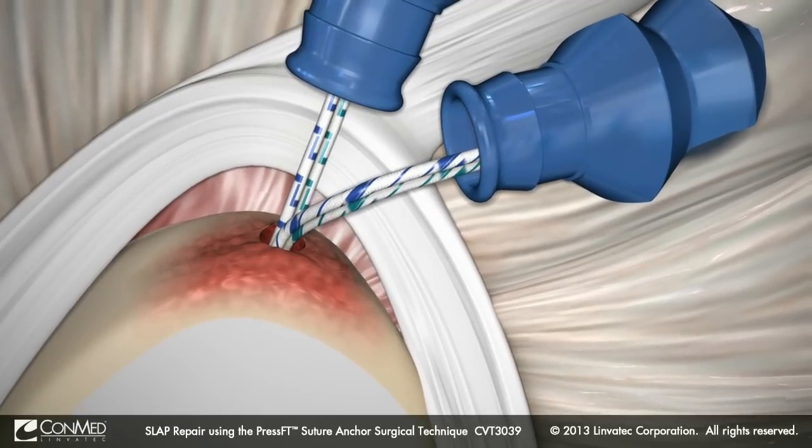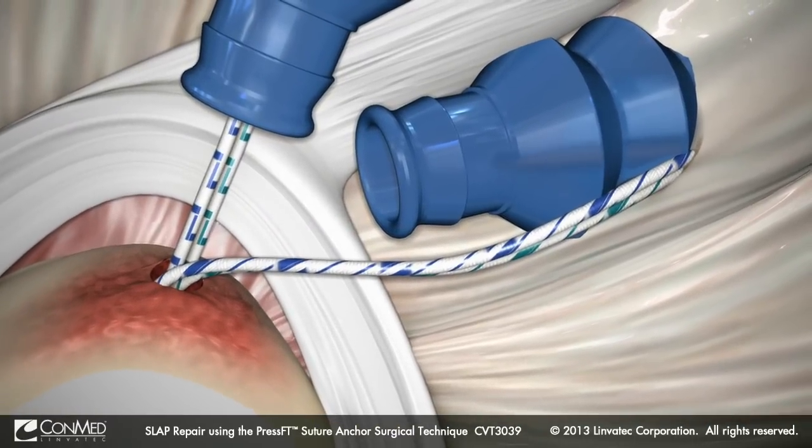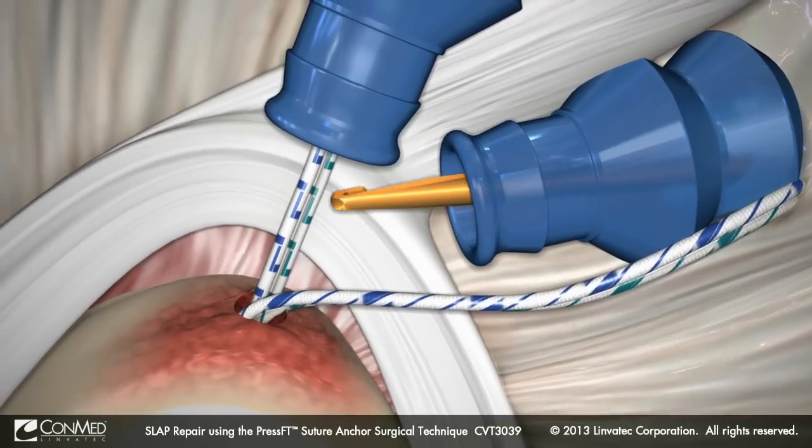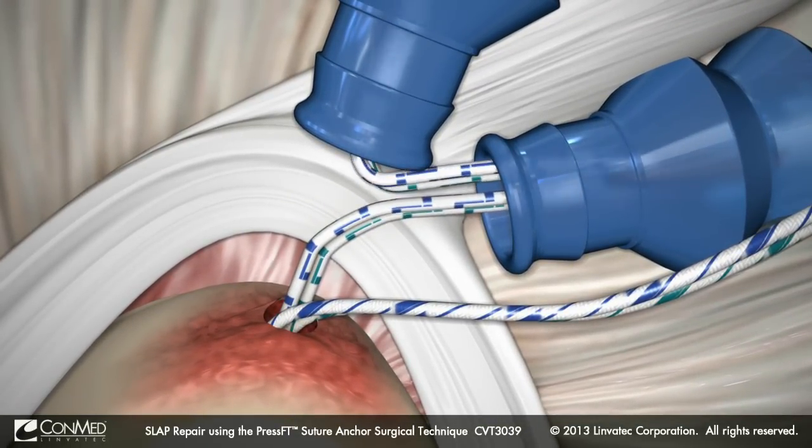Utilizing a switching stick, the sutures are then stored outside the cannula. Pull the remaining two suture limbs closest to the labrum into the same anterior mid-glenoid cannula.